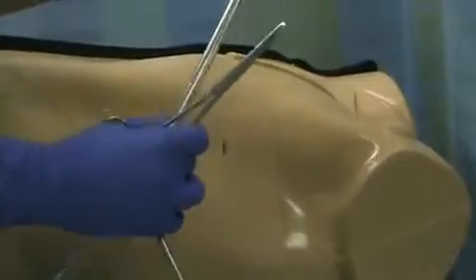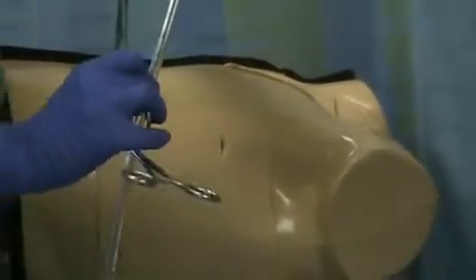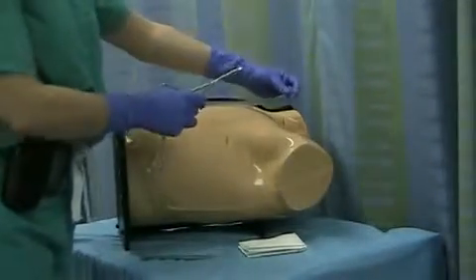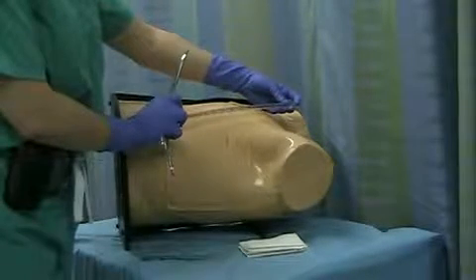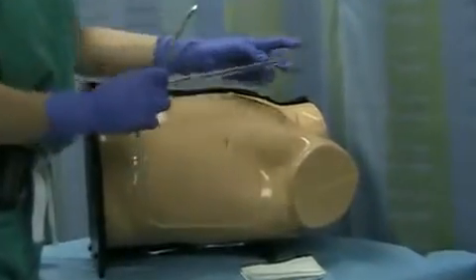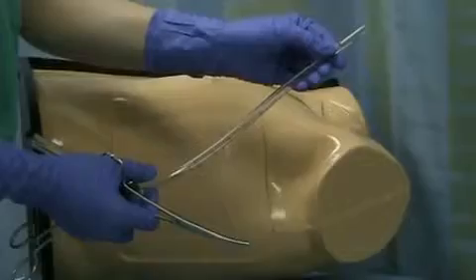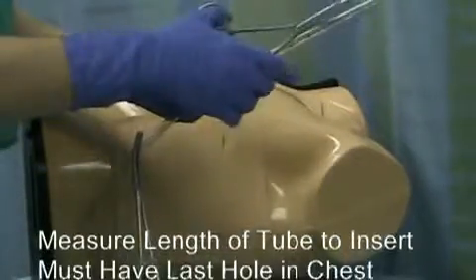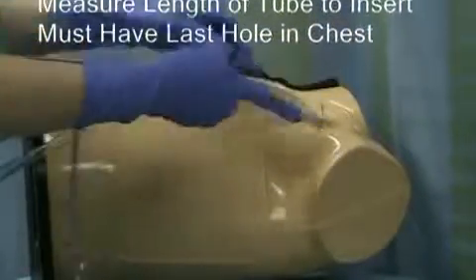Other things you notice, the last hole on this tube is right here, and shortly thereafter my numbers start. So I need to know how deep I want to put this in my patient. We oftentimes will look and just kind of gauge based upon the size of our patient where that lands. On this particular patient, it would land about 14 if I was aiming for the apex. Most important part is that that last hole is within the chest cavity rather than outside the chest cavity, because that tube will not function properly if it is. So go ahead and clamp.